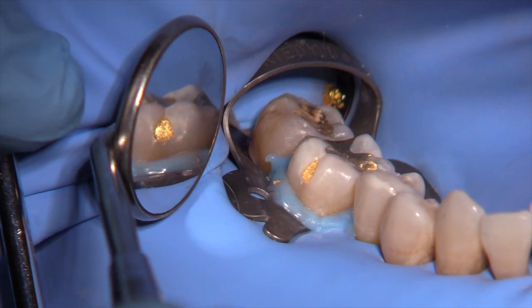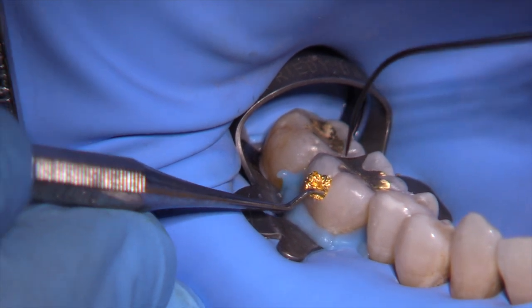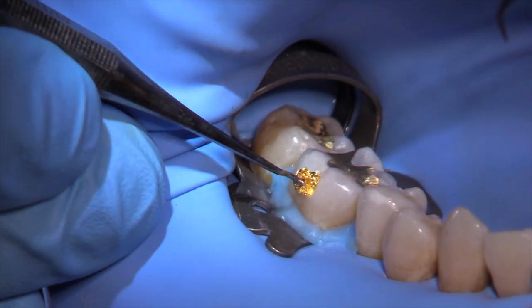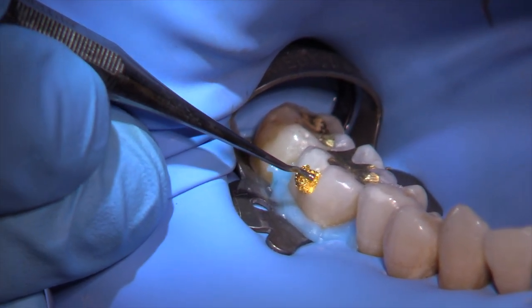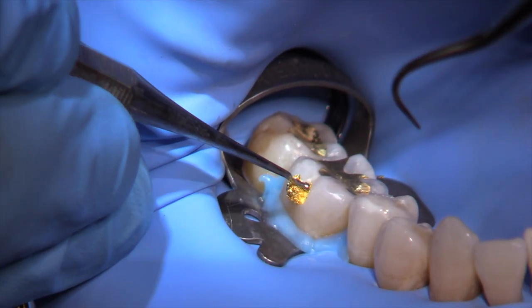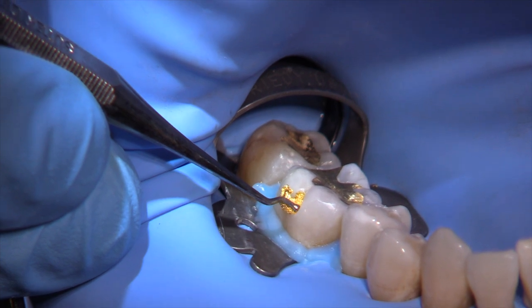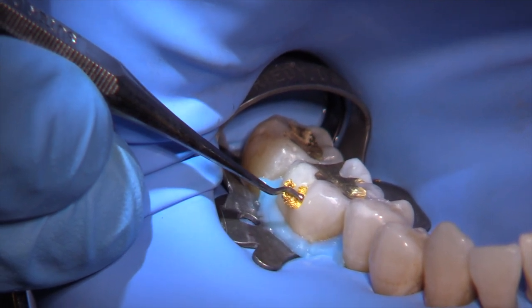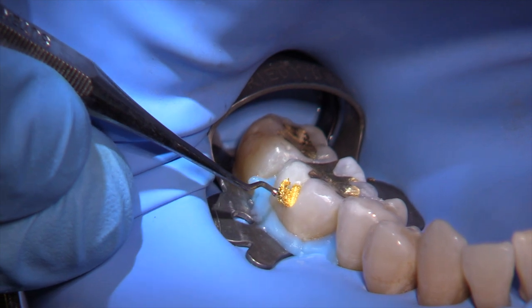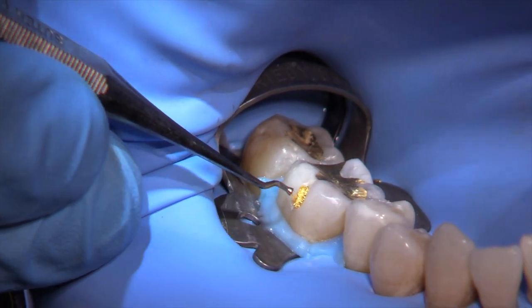We're shy of the margins and have to finish the rest with cohesive gold foil. With just a little touch it sticks very well — these are the van der Waals forces holding it in position. I really like the Tucker number one instrument because of its bayonet shape and wide end; it looks like a little inverted cone, which is great for condensing a larger area and directing it so you don't crush the margins as you're filling this very small gold foil.